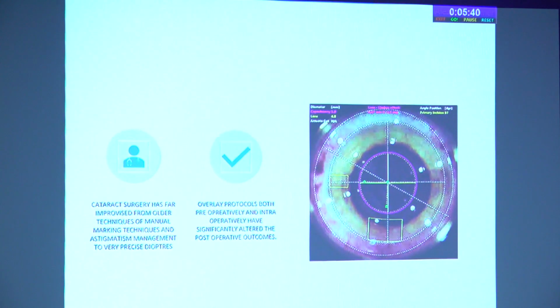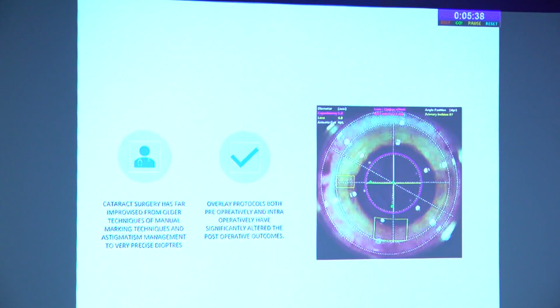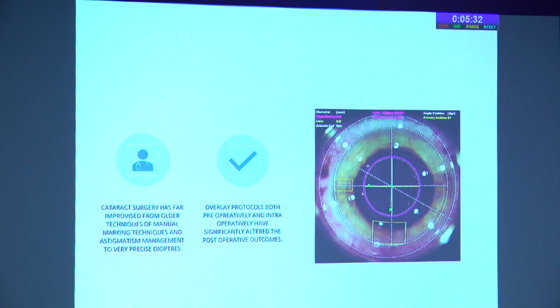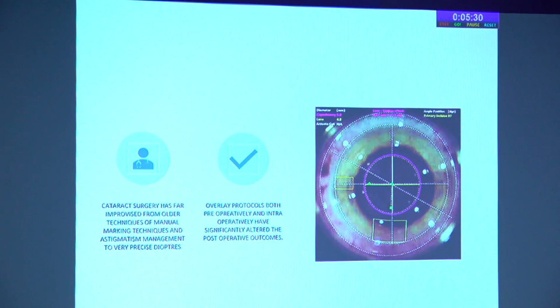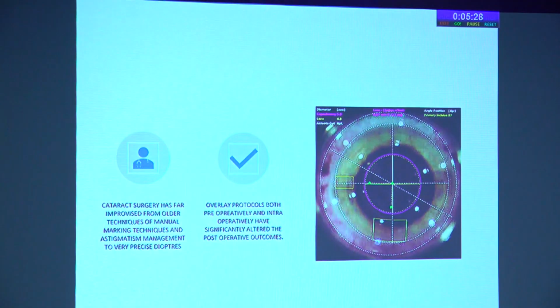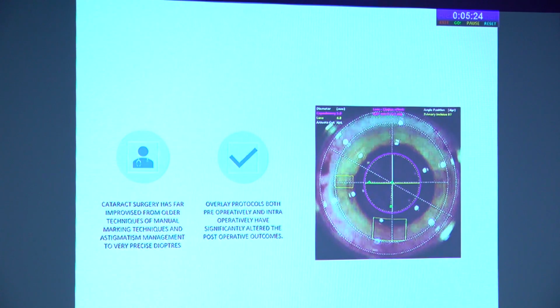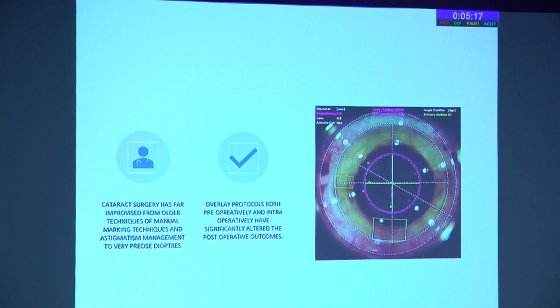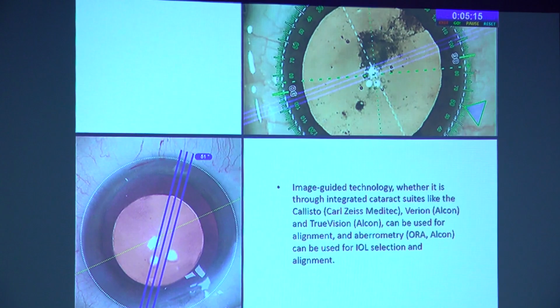It gives you a heads-up display of which axis exactly is required for you to implant your toric IOL. It will give you a marking as to where you have to place your incisions. In case you want to treat the astigmatism by placing your incision in the steep axis, it will tell you where exactly to do it, and it can also give you an overlay of your rhexis as well, so you can get a perfectly well centered rhexis, which is 5 mm, which will overlap the optic edge as well. So this is how it is.